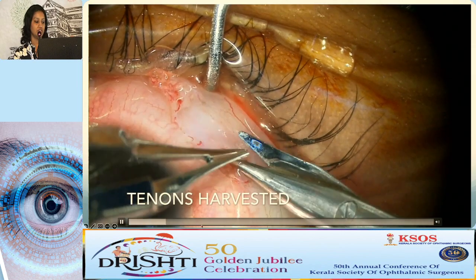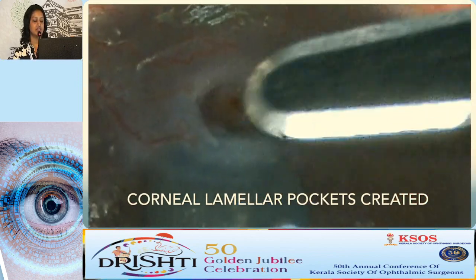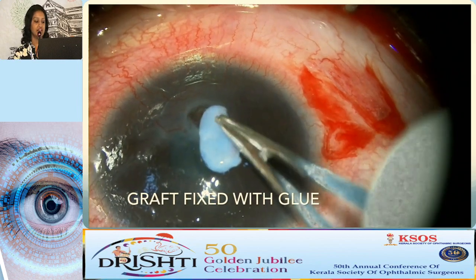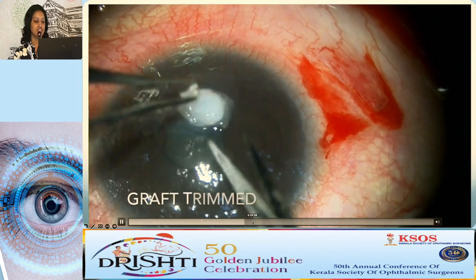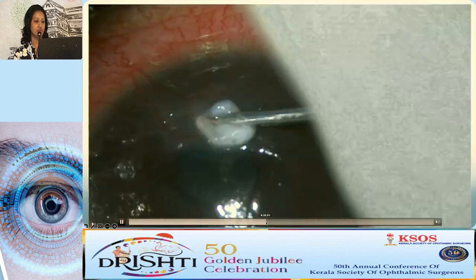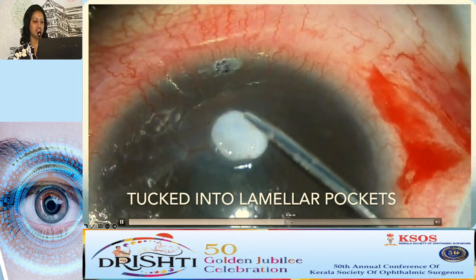Quickly moving on. The Tenon's is harvested. So this is the important step, where you create soft lamellar pockets around the corneal perforation. And once you've done that, you just size the Tenon's graft enough, trim it, and then you can use probably an iris repositor to just tuck it into those lamellar pockets that you have created all around.